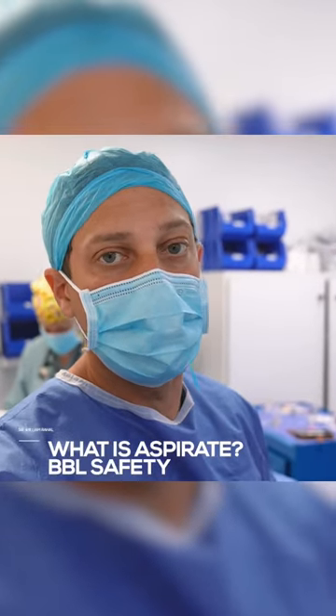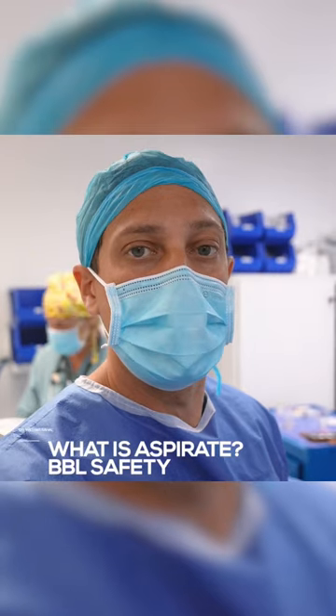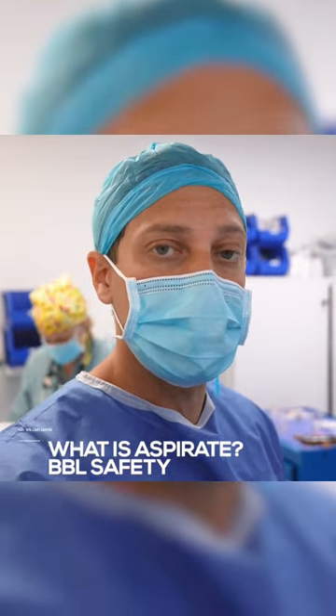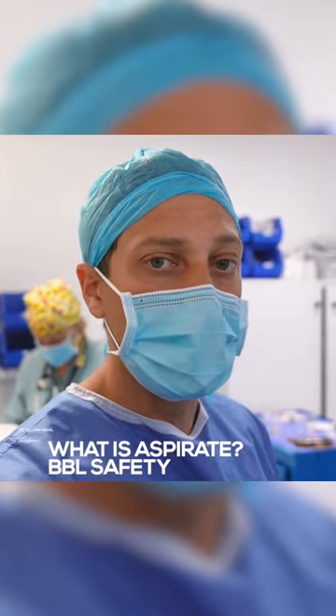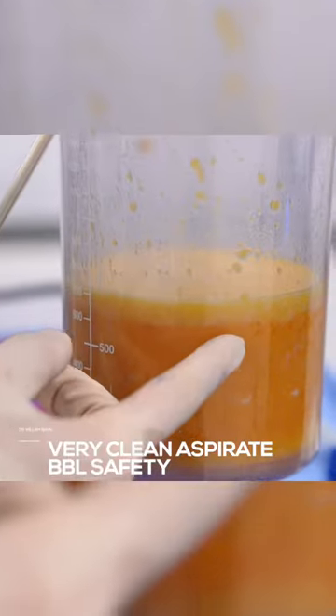What is aspirate? Aspirate simply means what comes out. A lot of times you hear about limits of how much fat you can take out, and that's kind of true. You could take out more than five liters, but the fat has to be very clean. Let me show you what I mean.